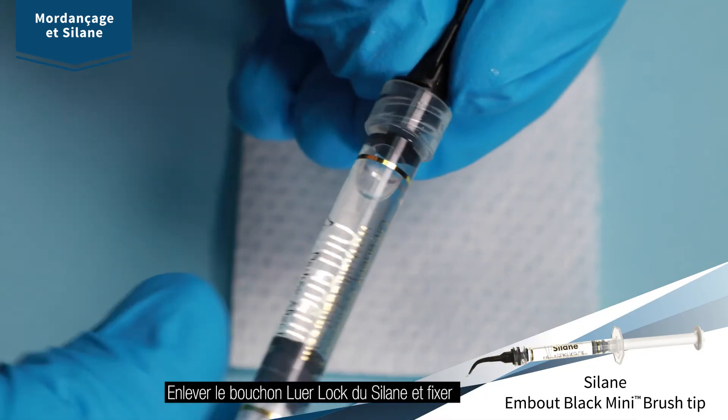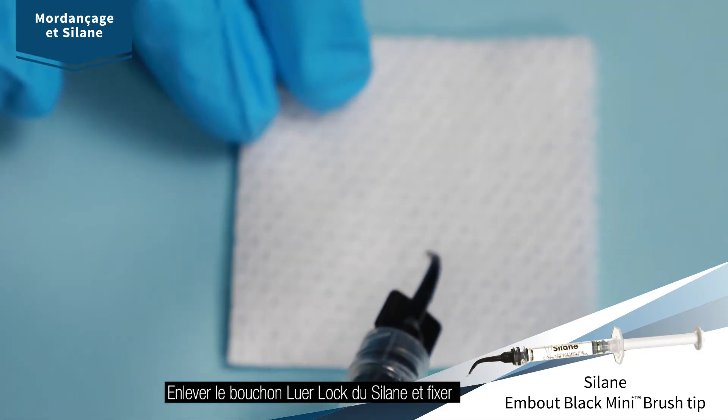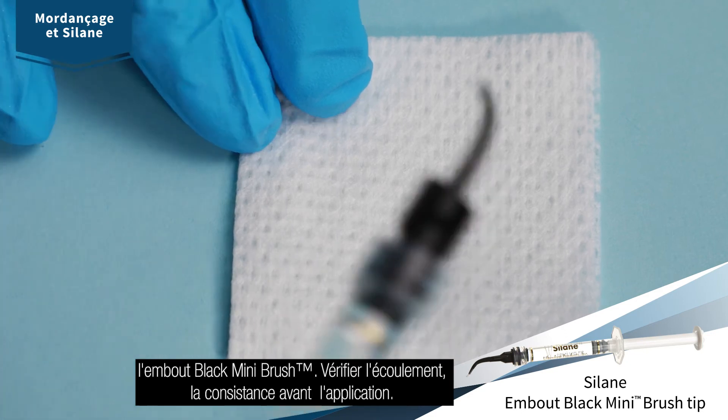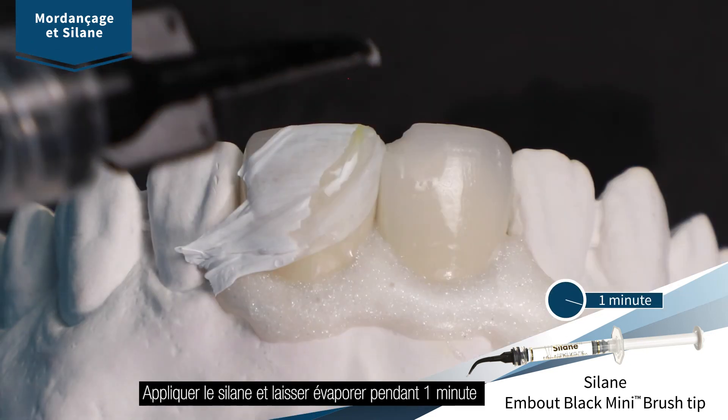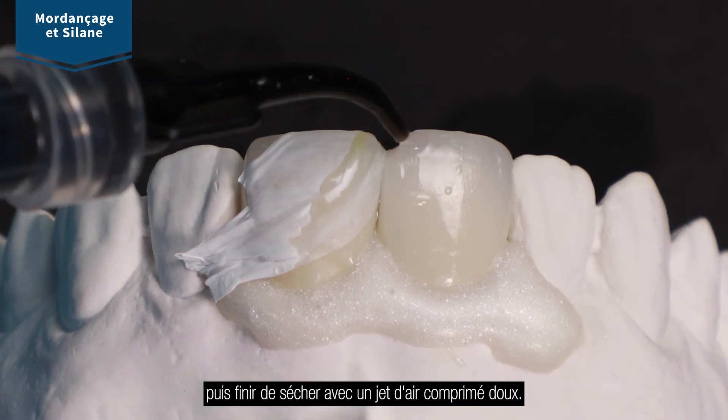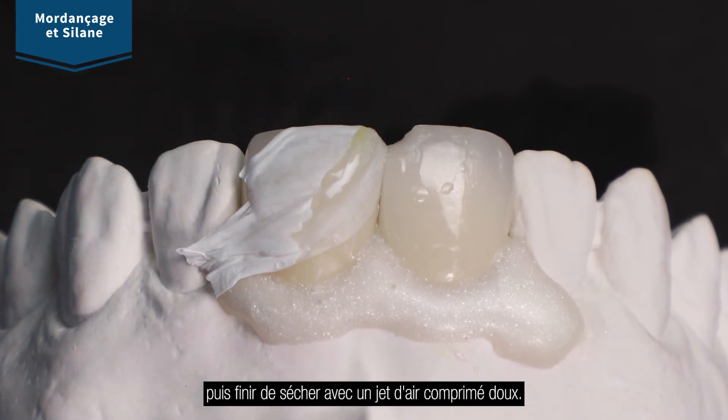Remove luer lock cap from silane and securely attach black mini brush tip. Verify flow and consistency before applying. Apply silane and let evaporate for 1 minute. Then blow with a gentle stream of air until completely dry.